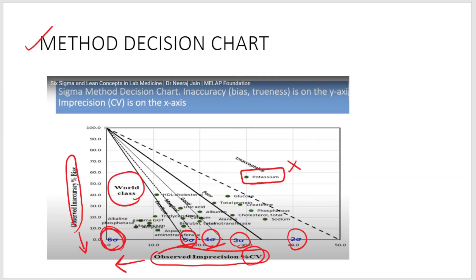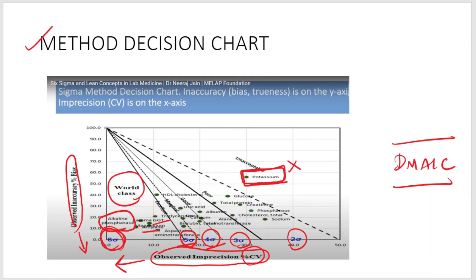In the Method Decision Chart, you can see that potassium lies in the unacceptable performance zone, so we have to change the methodology and make corrections for that method. On the other hand, alkaline phosphatase lies in the 5 to 6 sigma performance zone, which is very good. GGT and amylase are also analytes showing the best performance in this particular laboratory.